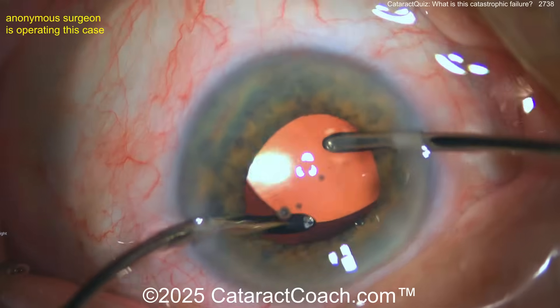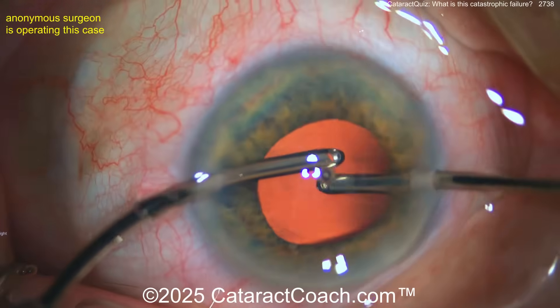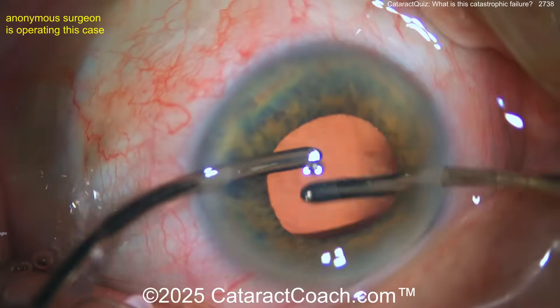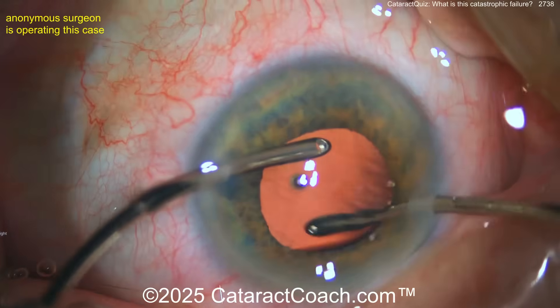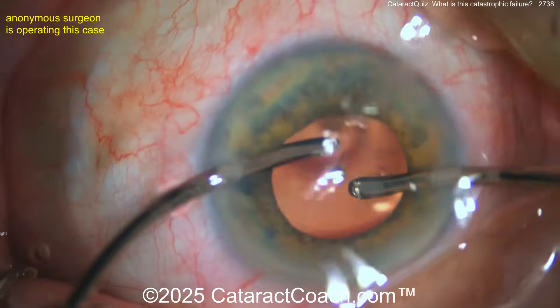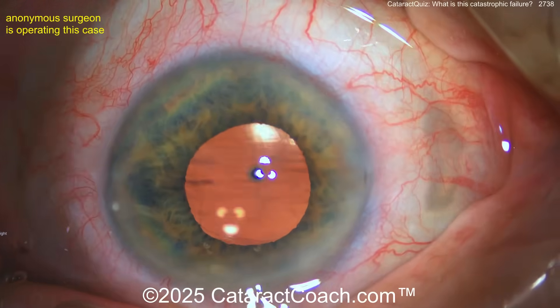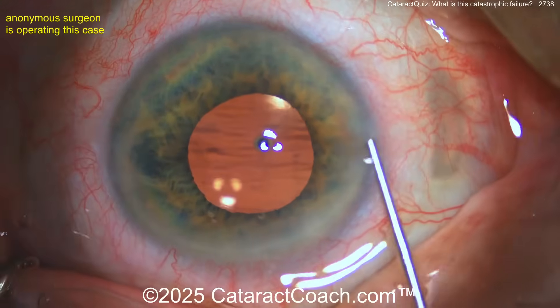There are going to be some challenges here. Going under the optic — remember at this point your goal is just to get out of the eye; you're done. Don't play around so much. The enemy of good is perfection. You go for perfection and then you get into a heap of trouble. The title said catastrophic — I'll tell you more.